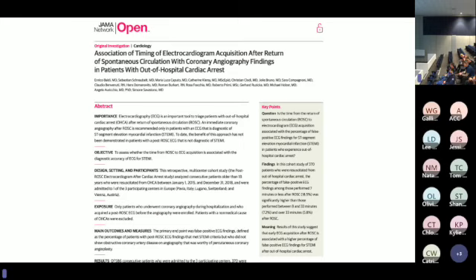Any opinions on that? It's an interesting question, isn't it? Because you get ROSC, like quick, let's do an ECG and find, no, we've got to wait 10 minutes. Yeah, exactly. And you're like, well, should we have something? Yeah.